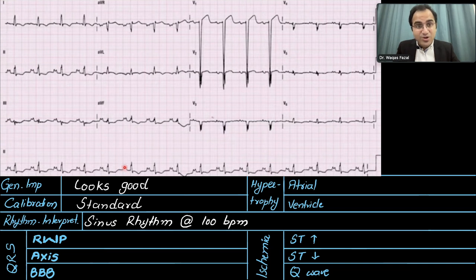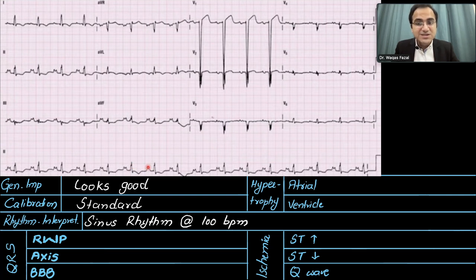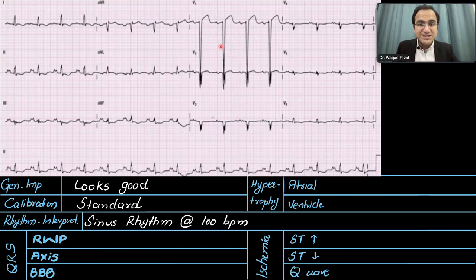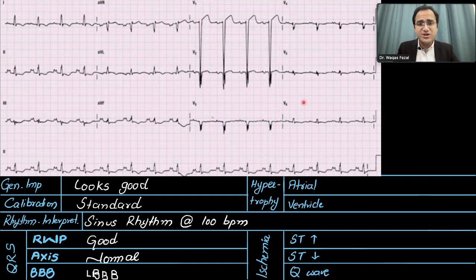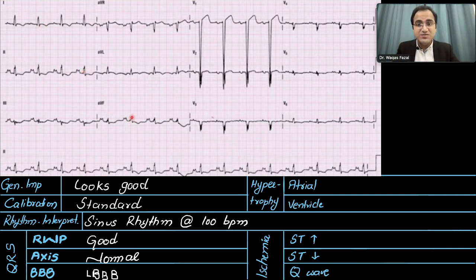For the rhythm, P waves are present and followed by QRS complexes — sinus rhythm. Calculating the rate: there are three large boxes between two QRS complexes, so the rate is 100 beats per minute — sinus rhythm at 100 bpm. For QRS assessment, in R wave progression, V1 and V2 are negatively deflected and V5/V6 are positively deflected — R wave progression is good. For axis, both lead 1 and lead aVF QRS complexes are positively deflected — normal axis.